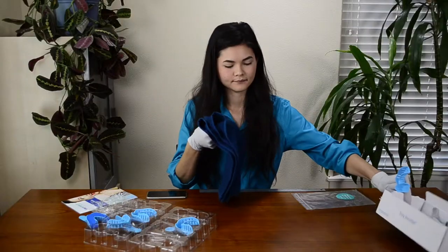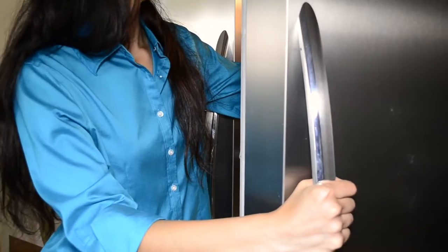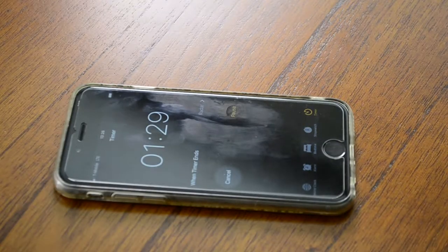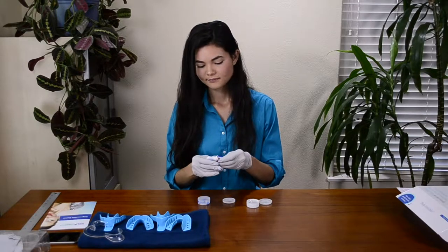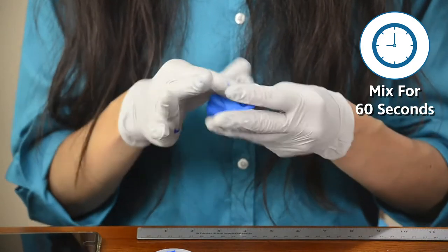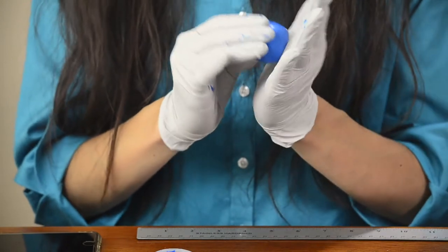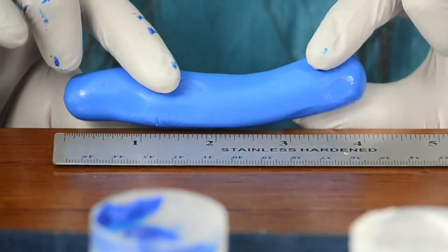If your trays fit, choose a clean, brightly lit area to make your impressions. Then after 30 minutes is up, remove one blue and one white putty from the refrigerator. Remove the putty from the containers. You will have 90 seconds to prepare the impression tray once you start mixing the putty. The tray should be in your mouth by the end of the 90 seconds prep time. Mix the blue and white putties together for a full 60 seconds, mixing rapidly until the putties become one solid color. Roll the mixed putty between your hands to create an even looking 4 inch log. This shouldn't take more than a few seconds to roll. You can use the ruler to make sure you have the right length.